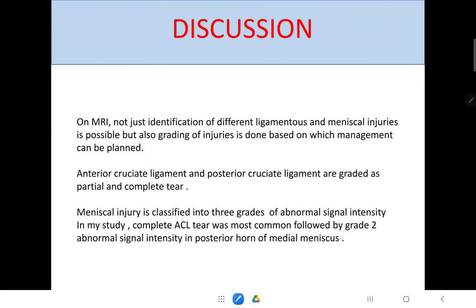Coming to the discussion, on MRI it is not just the identification of different ligamentous and meniscal injuries, but it is also helpful in grading of the injuries. Based on this grading, the management can be planned. Anterior cruciate ligaments and posterior cruciate ligaments are graded as complete and partial, whereas meniscus injury is classified into 3 grades of abnormal signal intensity. In this study, complete ACL tears were most common.